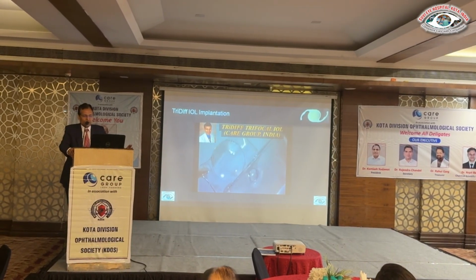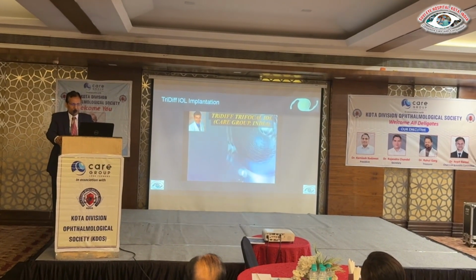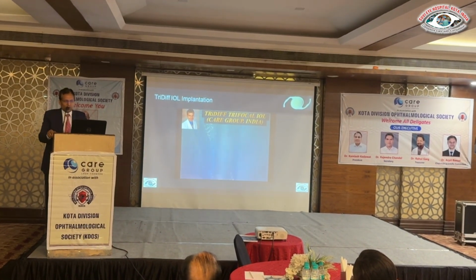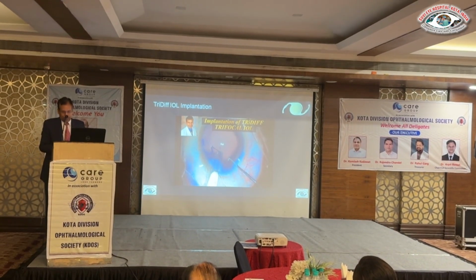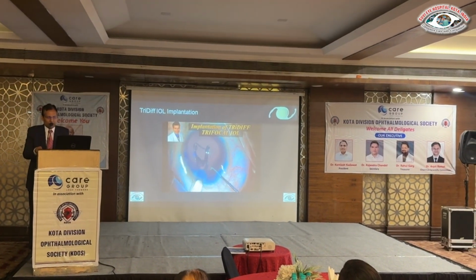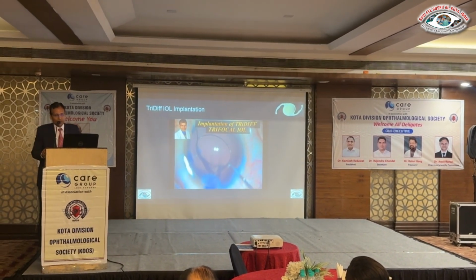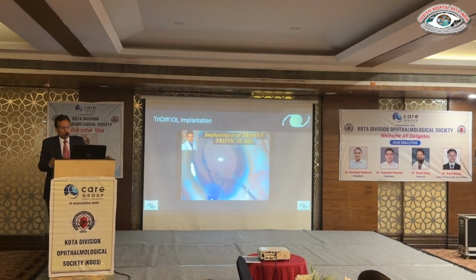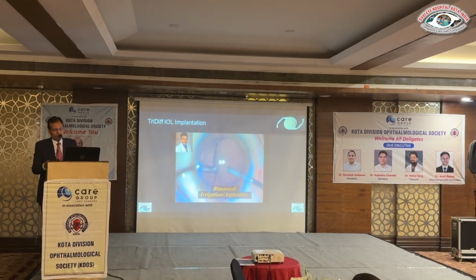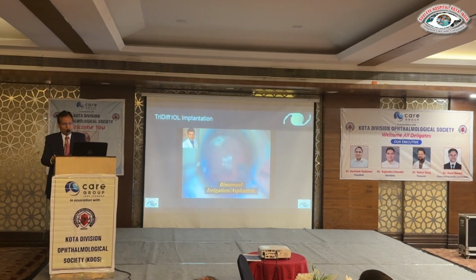So this lens is a plate design, hydrophobic acrylic material, and you can see the rings, and the loading of the lens is straightforward and simple, and this is the loading of the lens into the capsular bag and implantation into the capsular bag. You can use the technique such as hydro implantation, but I prefer to use it under the viscoelastic to avoid any problem.